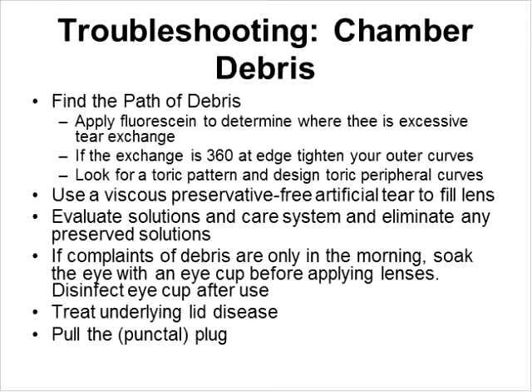If complaints of debris are only in the morning, where the patient will say, oh, I put my lens in, an hour later it fogs up, but then once I refresh it, I'm great for the rest of the day, well then this is where an eye cup can be very helpful. The patient can soak the eye in the morning before they put their lens in, and it'll remove all of the debris that's stuck onto the eye, and they should be a lot better. And again, treat the underlying lid disease.